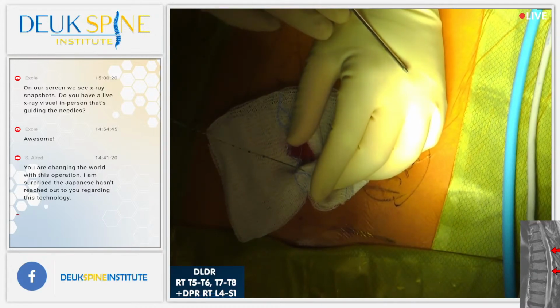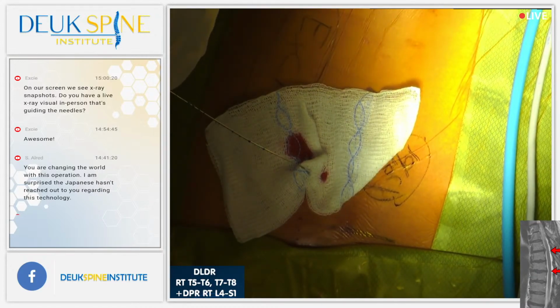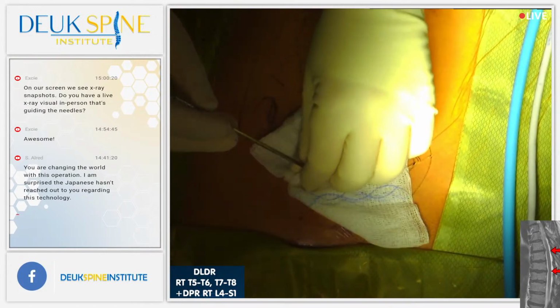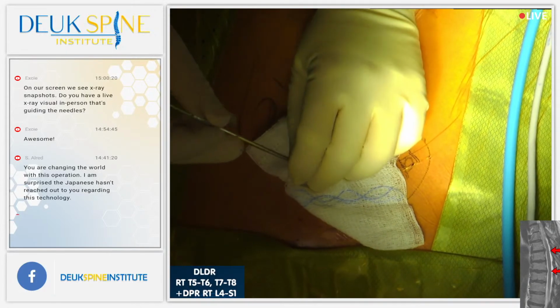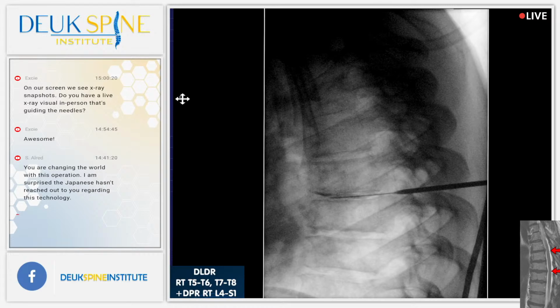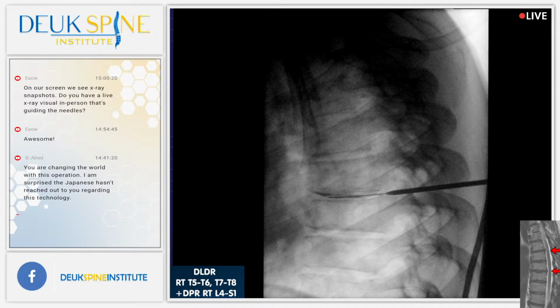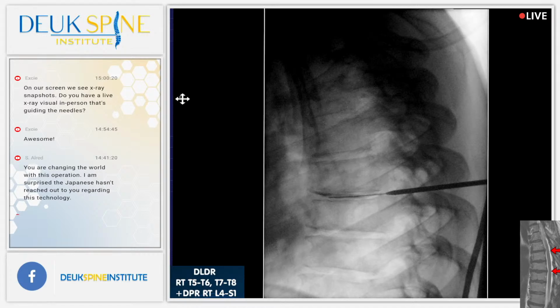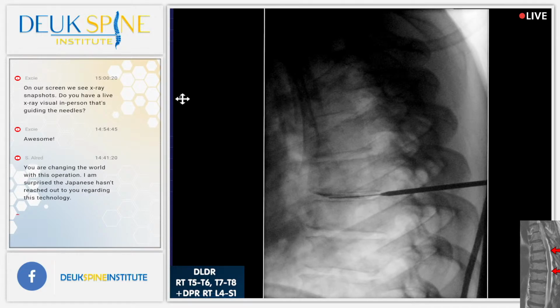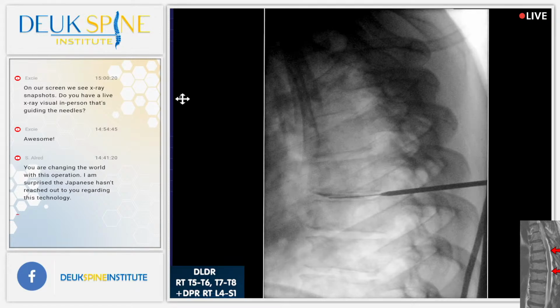So we're going to use a dilator to slide down the guide wire. You're going to watch on a lateral view as this dilator slides down the guide wire right to where the back of the herniation is. You guys see that? All right. I'm actually feeling that we're at the back of the disc right now. Okay, good. Now let's get an AP. We're going to just verify on the AP view.